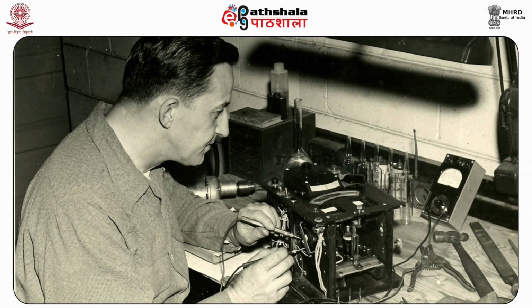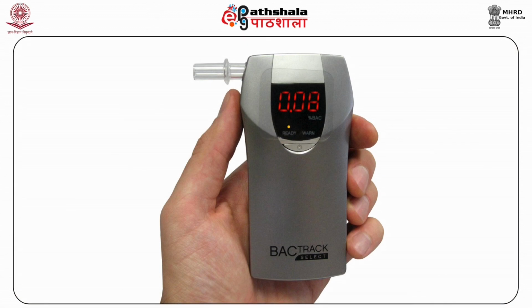Many studies and researches have been made from time to time in this field, but it is widely accepted that Dr. Robert Borkenstein was the first to create a device that was able to determine the BAC by using a breath sample. Since 1954, the breathalyzer has undergone several modifications, but the basic principle and design of the instrument remain the same.